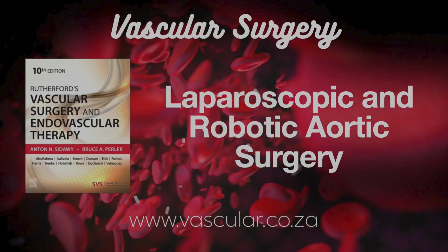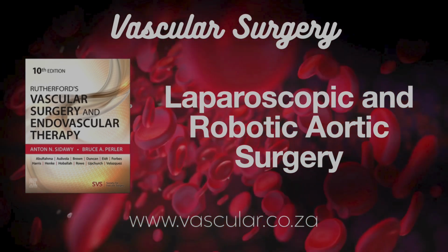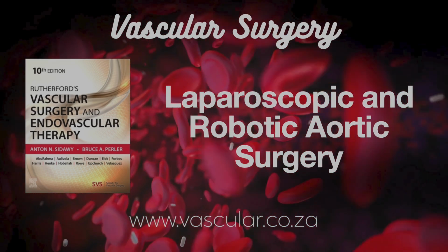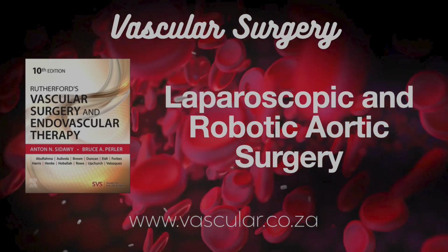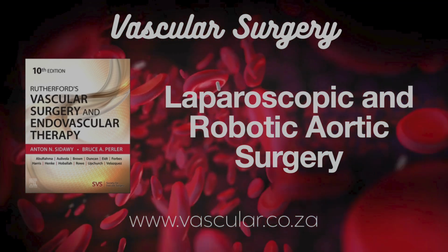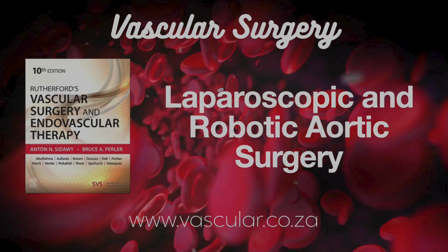Really? Just left there? Yeah, apparently. Then, once everything's connected, they lower the gas pressure inside the abdomen. Why lower the pressure? To check carefully for any bleeding. Small veins especially might have been squashed by the higher pressure, so lowering it lets you see if they start oozing. Then they put the colon back over the graft. Fascinating detail about leaving the graft in.